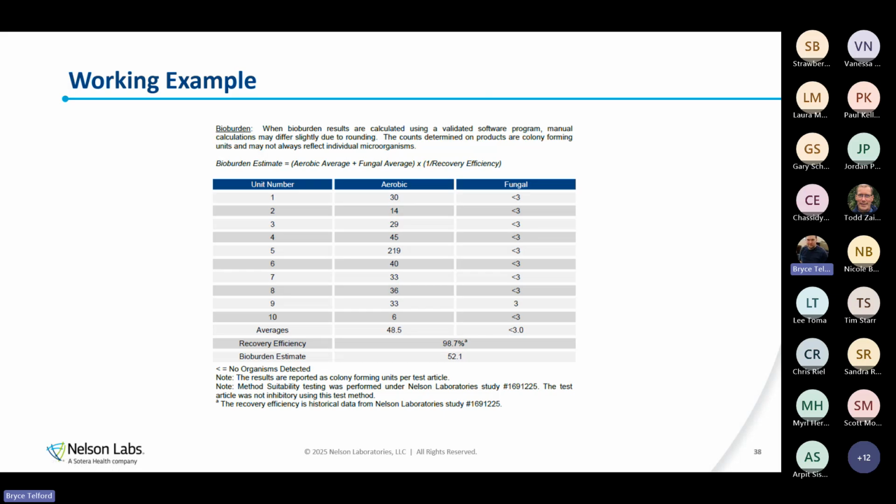For something such as ethylene oxide, generally you're not testing 10 samples. You're testing something more along the lines of 3 samples. And that is indicative of the bioburden being that much more important. So we want the bigger statistical model for a bioburden-based sterilization. Yeah, that makes sense, because some of these discussions become pretty academic when you're comparing small changes in bioburden in an EO modality.